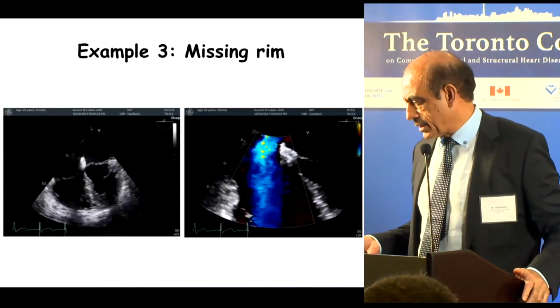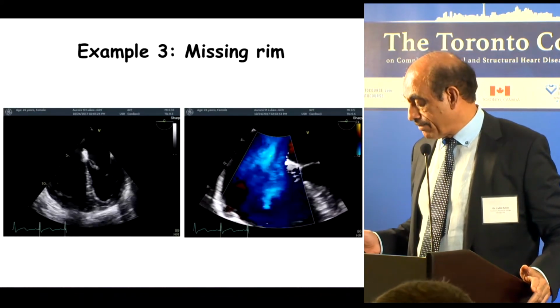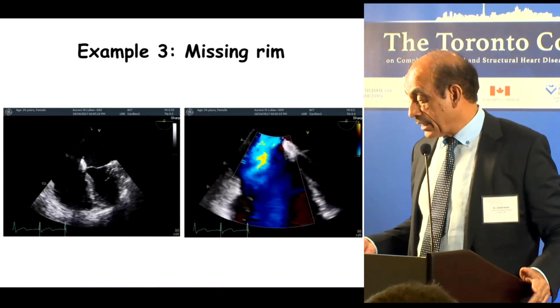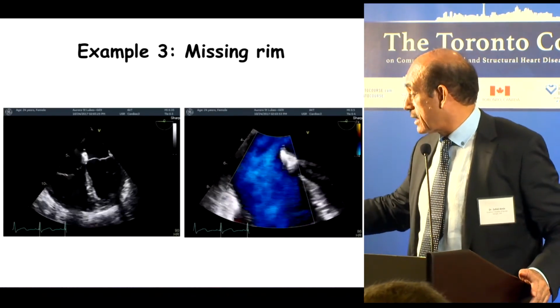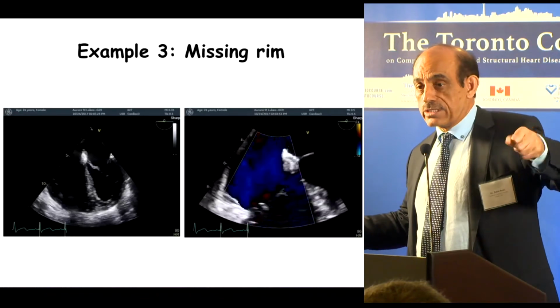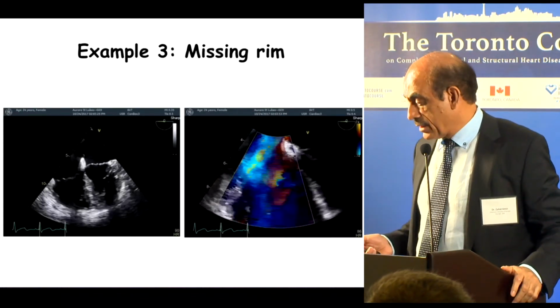Next, sorry, I can do this. So here's example 3. This is a patient. If you can see on the 4-chamber view again on the right and the left. This on the right side. What you see is a transducer slightly clockwise. If you keep going clockwise, you will start seeing the right upper pulmonary vein in these patients.